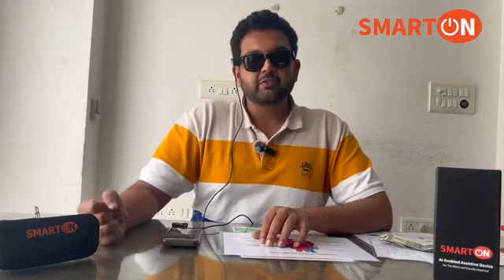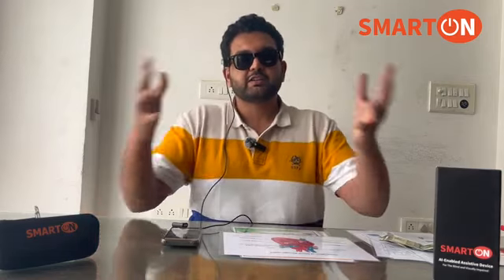I'll give you the first demonstration of a description of what is ahead of me. So I'll select the Smart Eye feature. "5, 4, 3, 1."